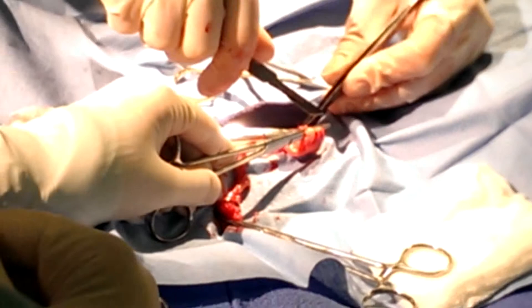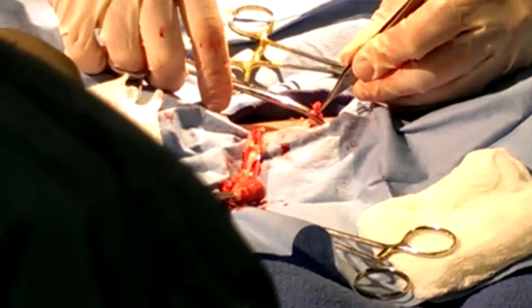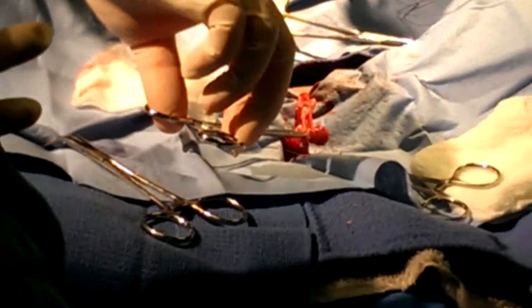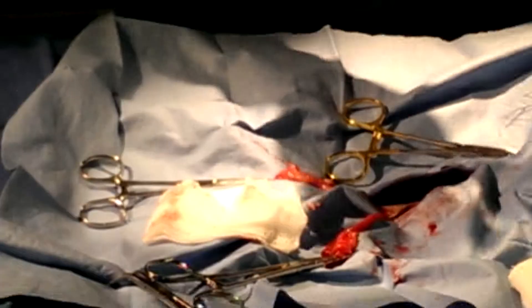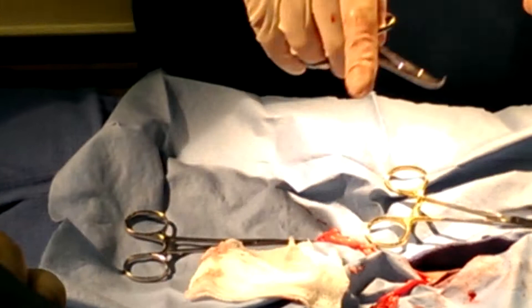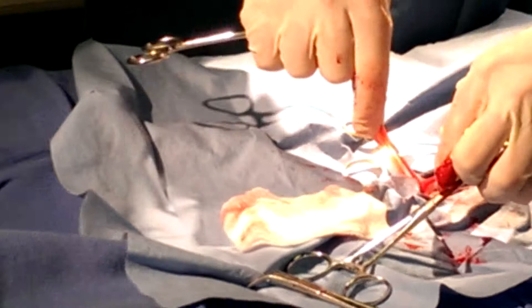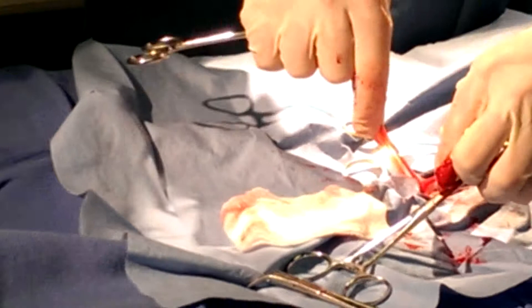Look for that bleeder again — just hang on to that tip and release. Everyone looks happy — good so far. These two hemostats have to stay on because this is still connected to the blood supply. If you took these off right now they would start squirting blood. So bring this back and now we work our way down to the cervix and the uterus. You can see the two uterine horns and the two uterine arteries — the red lines about a centimeter underneath them.